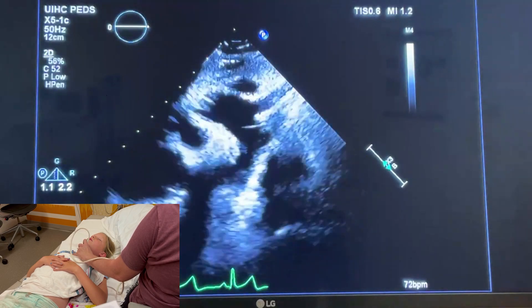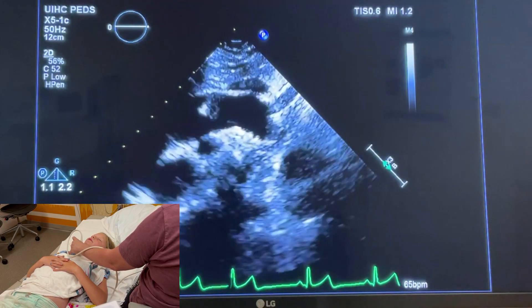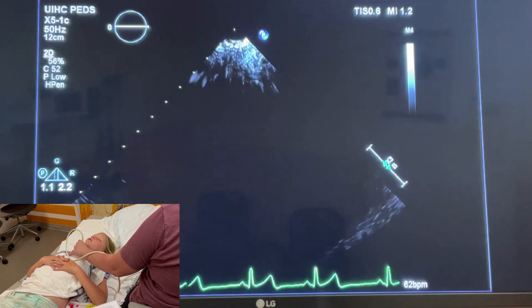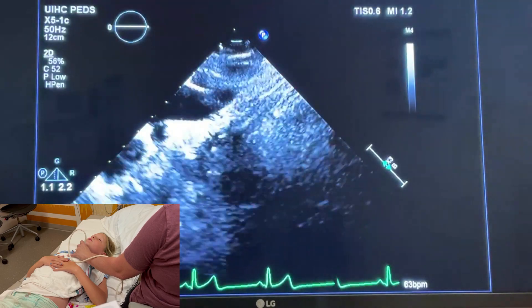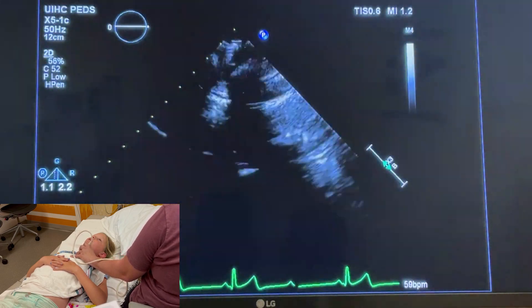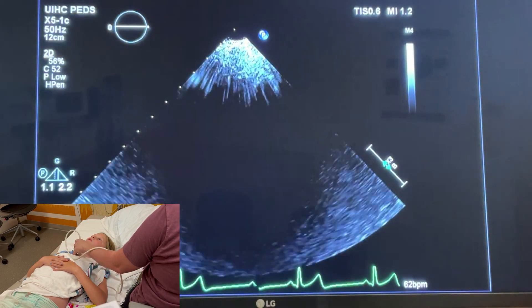Once you've gotten those views, we're going to do the suprasternal sweep. You have your transducer with the notch facing up at 12 o'clock, and you're going to tip over to the right shoulder — rock the tail of the transducer towards your left so the footprint is going towards the right shoulder.